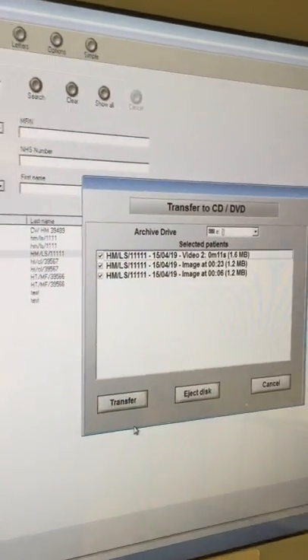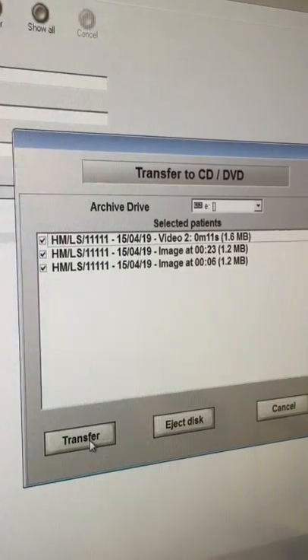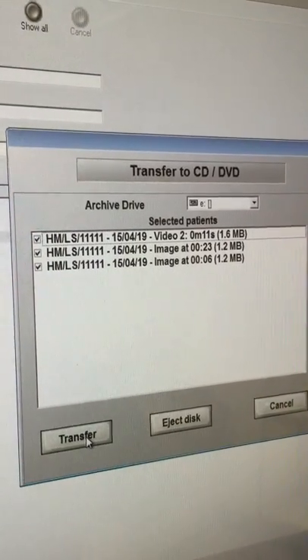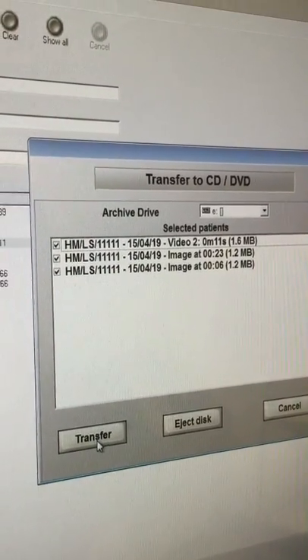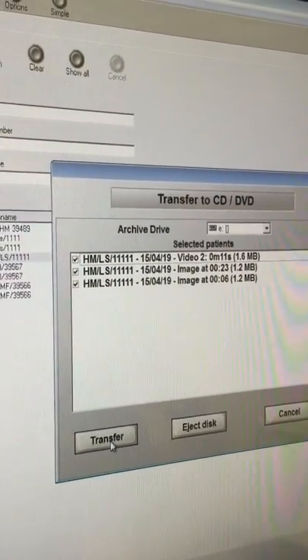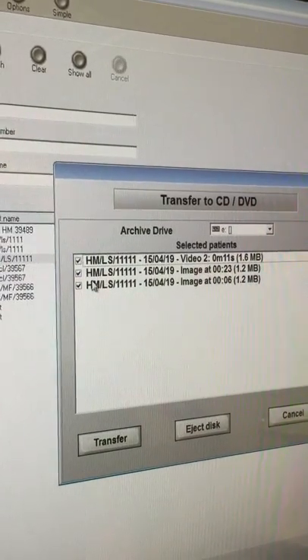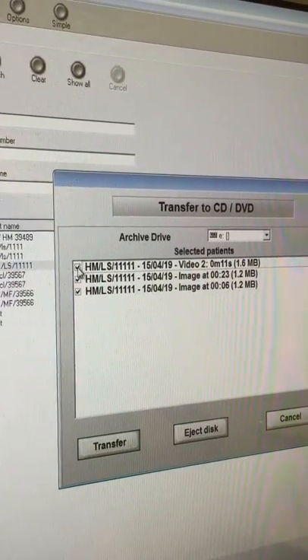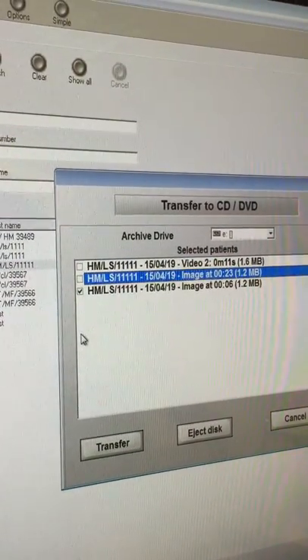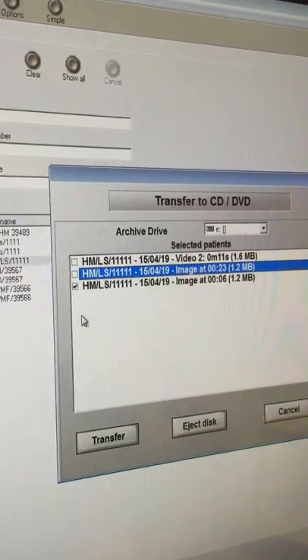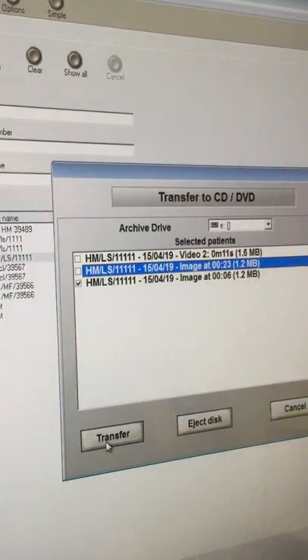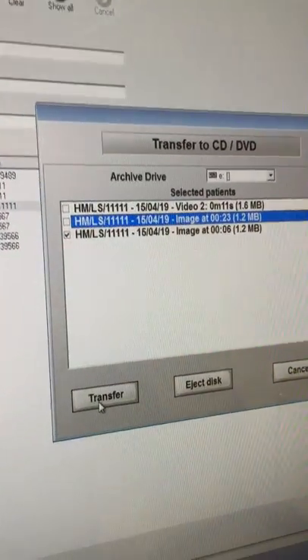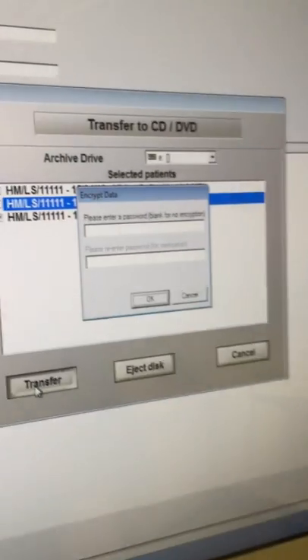At this point you will be asked if you wish to transfer the images and you will simply click transfer. For the purposes of the training video, I'm just going to uncheck two of them because otherwise it will take too long, but you will leave all of them checked and transfer the images onto the disc.